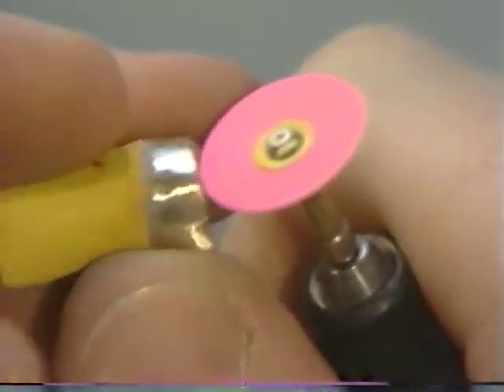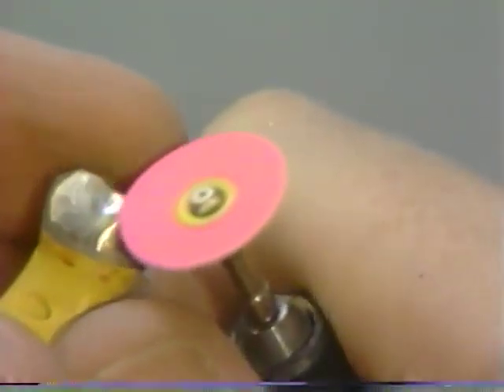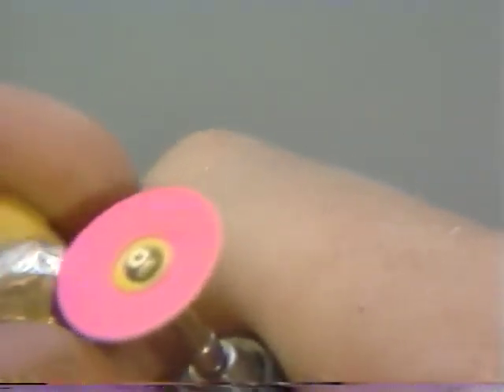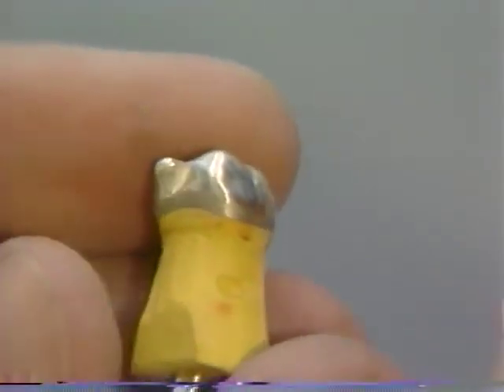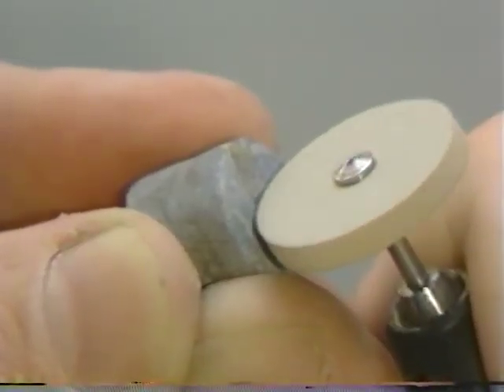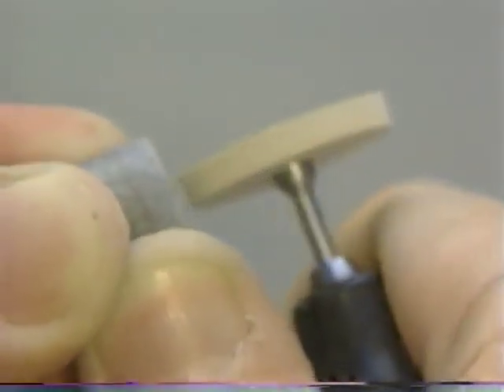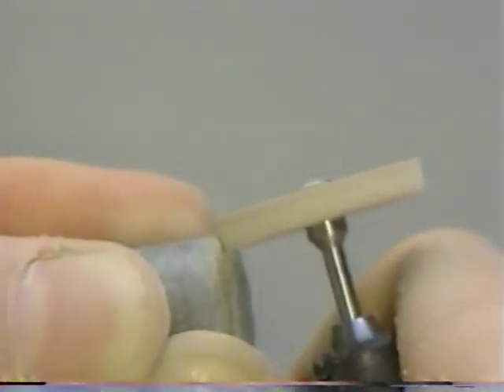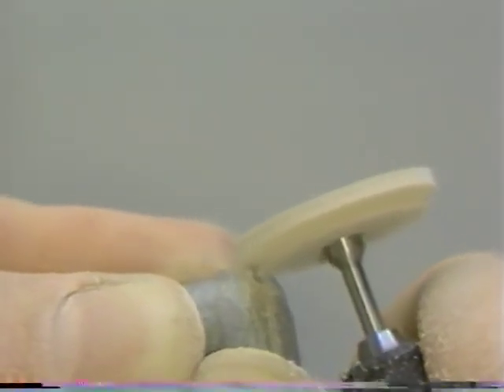When working with these types of abrasives, no facets should remain. Be careful not to remove too much gold from the cusp tips in the areas of the centric stops. This type of finish is acceptable to proceed with the next step of abrasive — a white flexi, the heatless wheel.